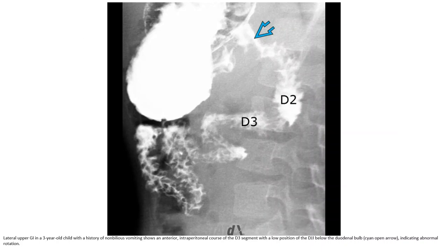Case example: upper GI in a three-year-old with a history of non-bilious vomiting shows an abnormal position of the duodenojejunal junction at the D3 segment, with a low position of the DJJ below the duodenal bulb, indicating abnormal rotation.